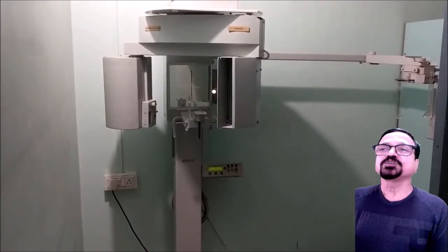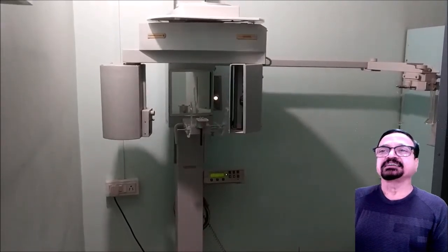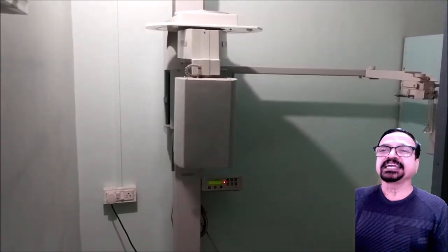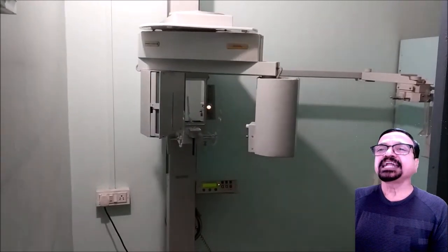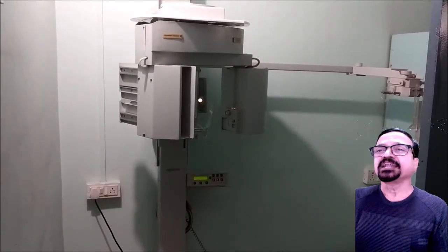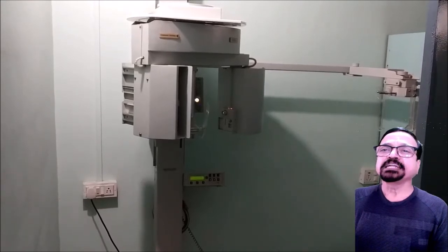So first the machine has gone to the 0 position, then the cassette has taken its place and the exposure has started. You can see the slit through which the exposure produced by the tube gets into the film, and while rotating it projects on the mandible and you will get a full view of the mandible. There is over correction from either side so that a full view of the mandible is achieved.